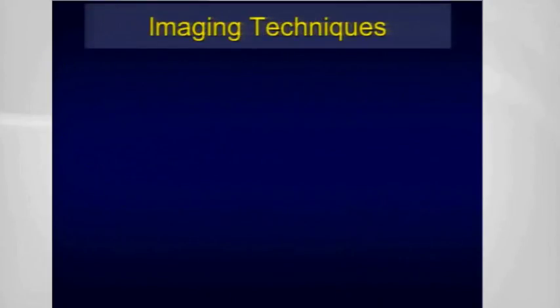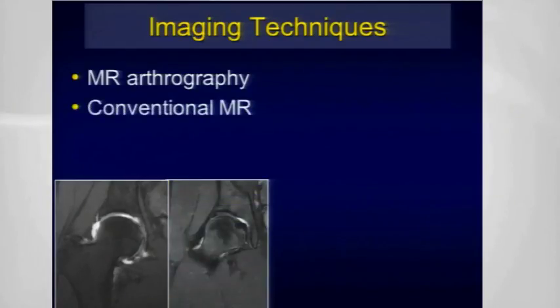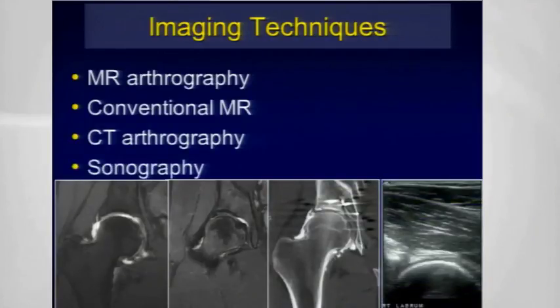Some of the imaging techniques that can be performed are MR arthrography, whether direct or indirect, conventional MRI, CT arthrography, as well as sonography.